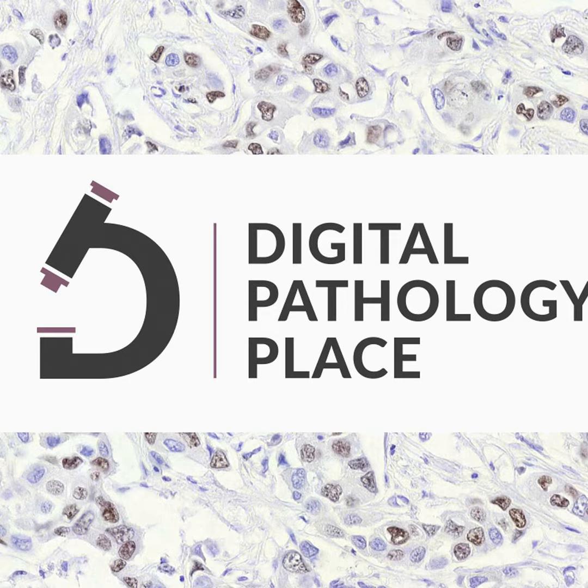were bladder neoplasia. So why is that? I start thinking, again, this is a hypothesis: if you looked at bladder biopsies, they look like 64 continents on a projection map, right? There's tissue everywhere. They're really challenging to look at by microscopy, and maybe digital makes them easier, right? So maybe you can actually be more accurate. Again, underpowered, all the disclaimers, but I thought that was really interesting. Two out of the 74 were bladder cancer categories, and that was more accurate digitally.